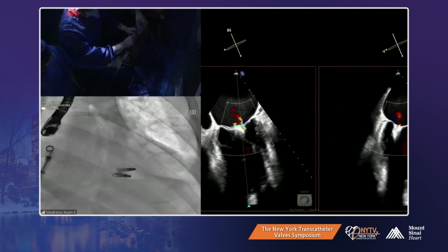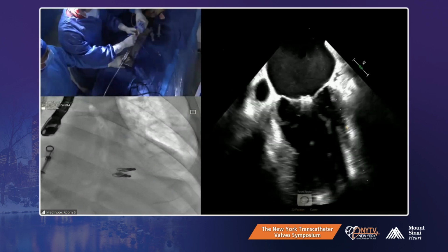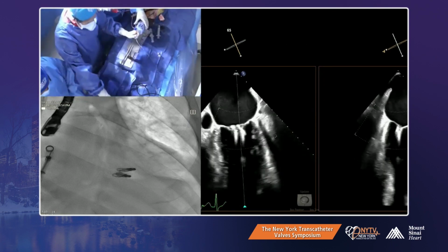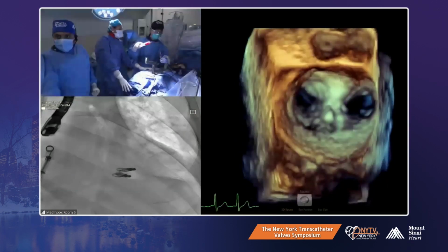Unfortunately, Eberhard Grube left because I wanted to tell him, because he's a non-believer in MitraClip and he was smiling at me, and I wanted to show him that it actually works. We'll send him the pictures and a video afterwards.